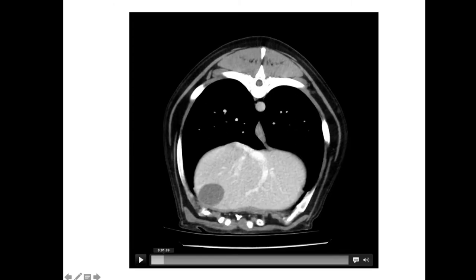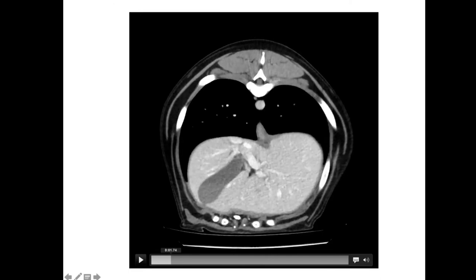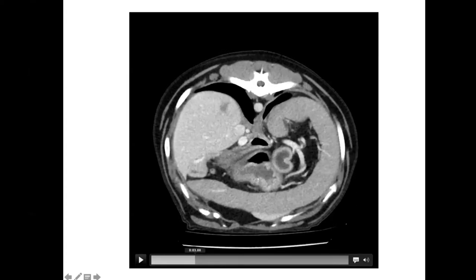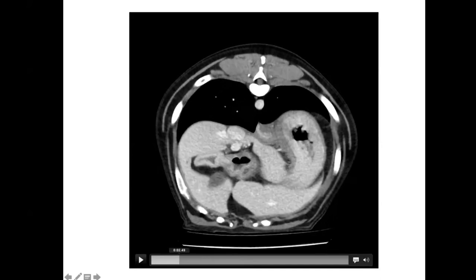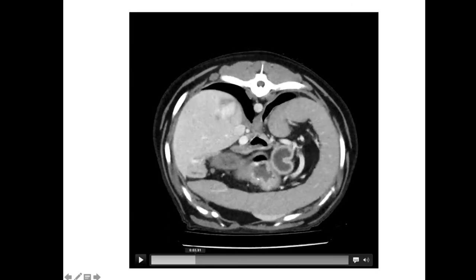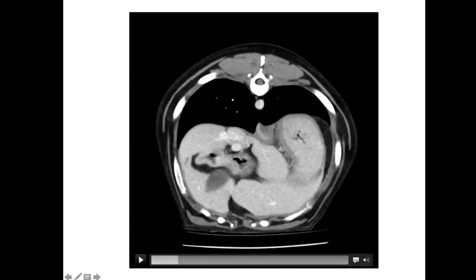For those of you not used to evaluating CTs — this is a transverse section through the cranial abdomen. This is the spine, we've got ribs, these are the lungs — right and left caudal lung lobes and the accessory lung lobe. This is the esophagus, this is the liver, and this is the gallbladder. We're going to take a little drive caudally and see what crops up. We've got the stomach moving into view — a little bit of gas, a little bit of fluid in the stomach, but nothing to get too excited about. This is the gastric antrum, and we can just see the pylorus — so this is the pylorus and then this is the start of the duodenum. Nothing in the stomach, nothing lodged in the pylorus.